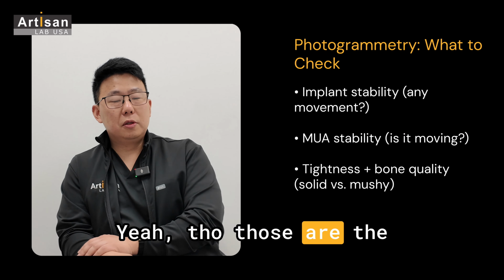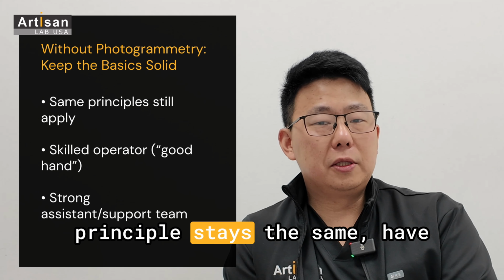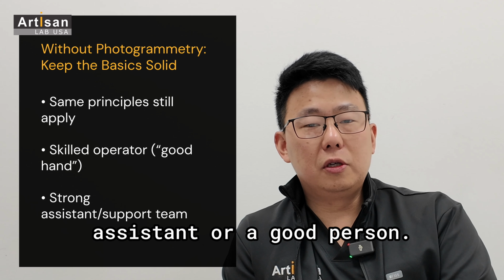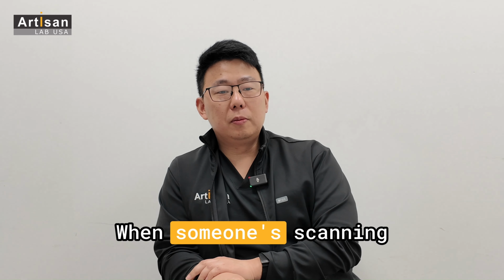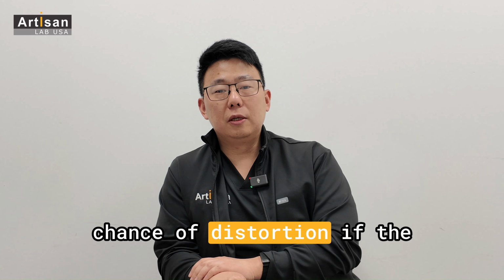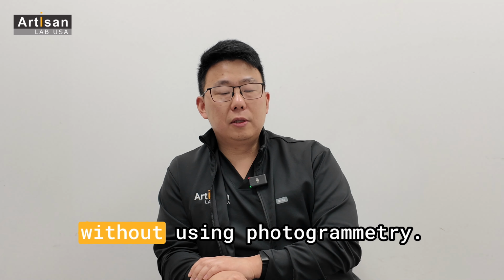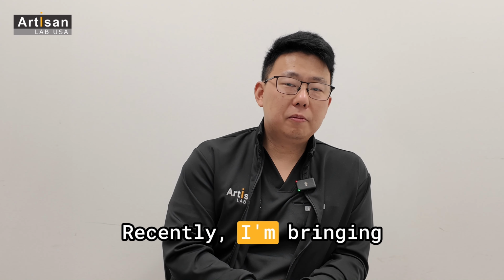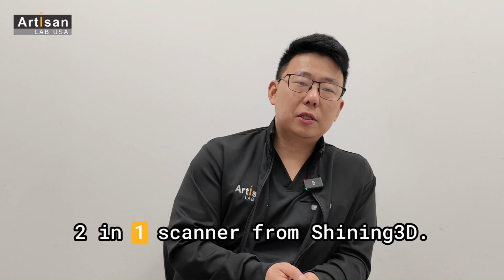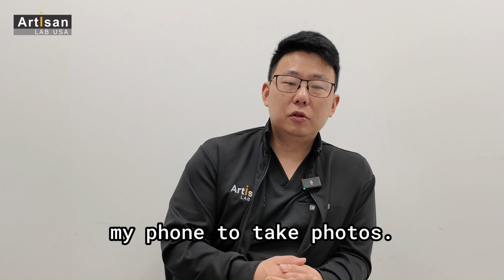But if you're not using photogrammetry data, then we have to make sure the principle stays the same. You have to have a good hand, a good assistant, or a good person scanning without photogrammetry technology. There's a higher chance of distortion if the person doesn't know how to take accurate records without photogrammetry. Recently, I'm bringing a photogrammetry scanner as well as the intraoral scanner. It's a 2-in-1 scanner from Shining 3D. And I'm normally using my phone to take photos.